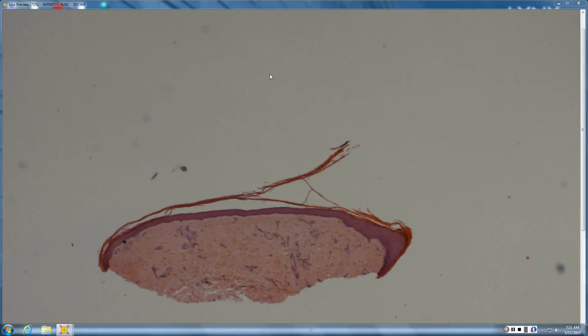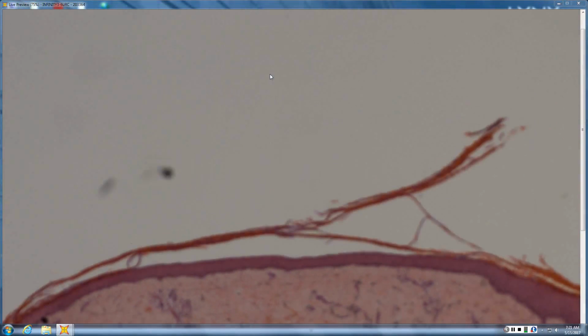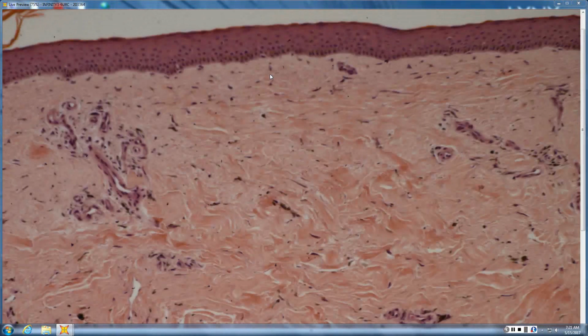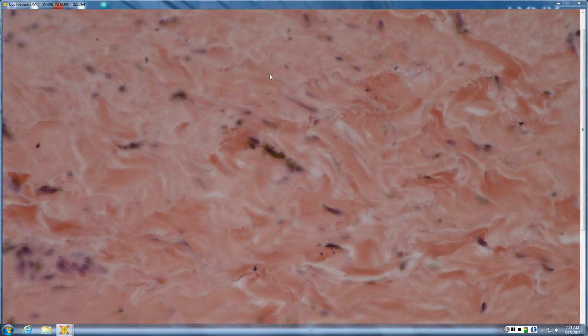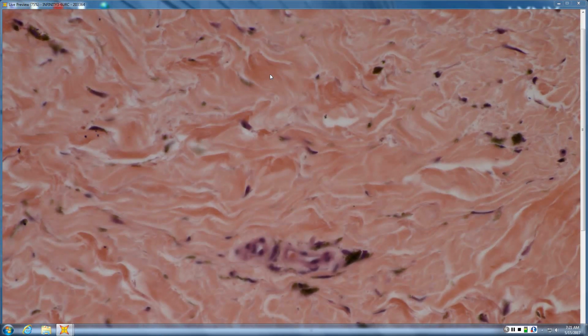Okay, flip this one around. So this one is minocycline hyperpigmentation, and it's just important to remember the different types of minocycline hyperpigmentation, and that you can certainly get deposition. This one, you could easily confuse with dermal melanocytosis, because it even has what appears to be almost dendritic melanocytes, but it's really just a dendritic form of these fibroblasts and macrophages that are picking them up.